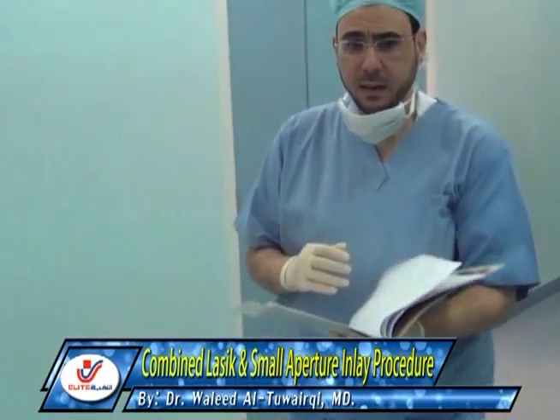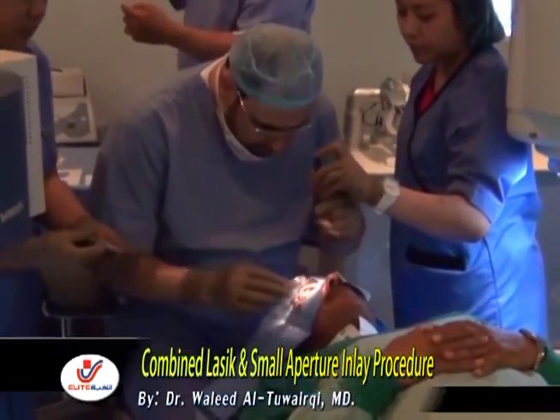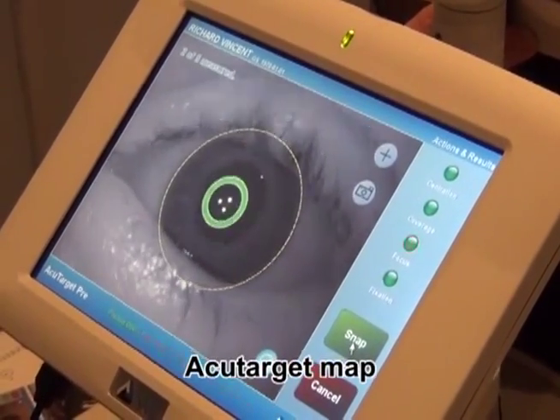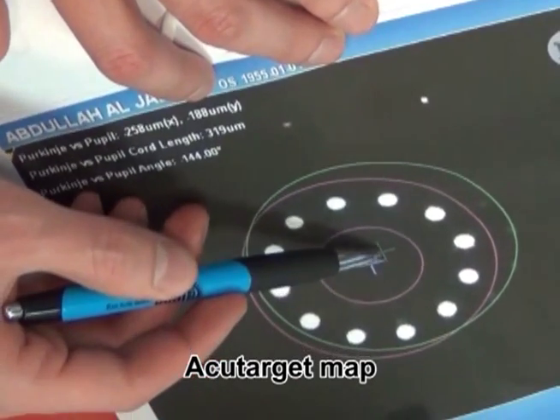We combine LASIK and a small aperture inlay procedure for correction of ametropia and presbyopia. The steps of the current technique: first, you get an AcuTarget map to locate the center of the pupil and the first Purkinje image, and to measure the distance between them.